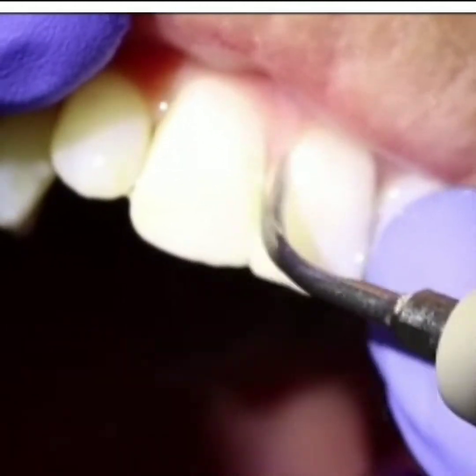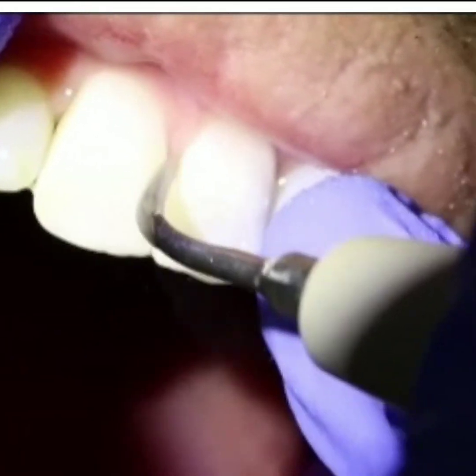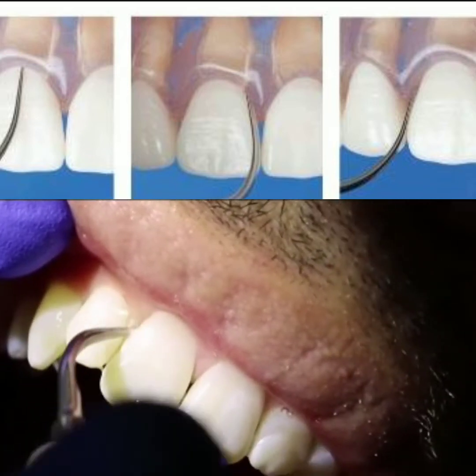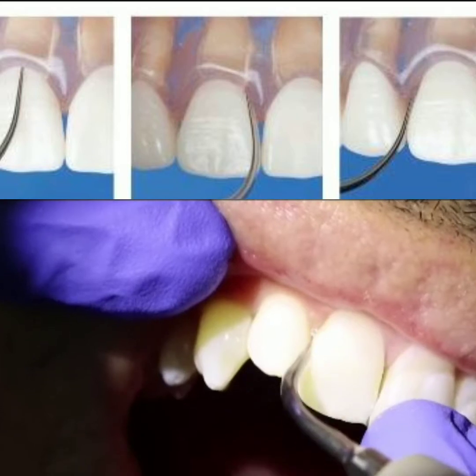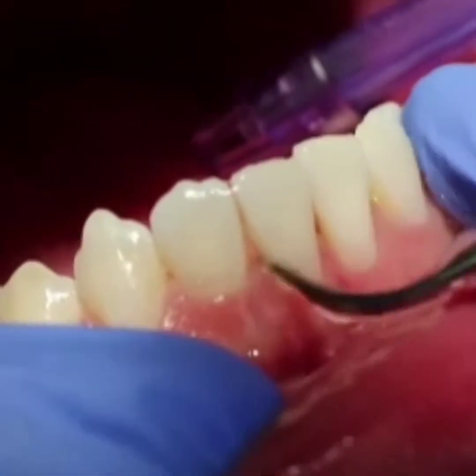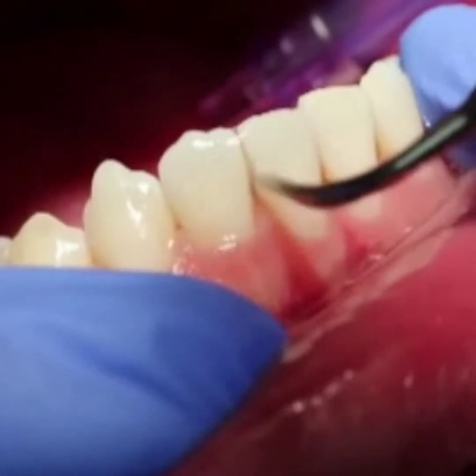In ultrasonic we have vertical adaptation position and horizontal adaptation position. For vertical angulation, the tip can be readily adapted to all the surfaces — facial, buccal, distal, lingual — without changing the fulcrum. For horizontal, the tip position is perpendicular to the long axis of the tooth.